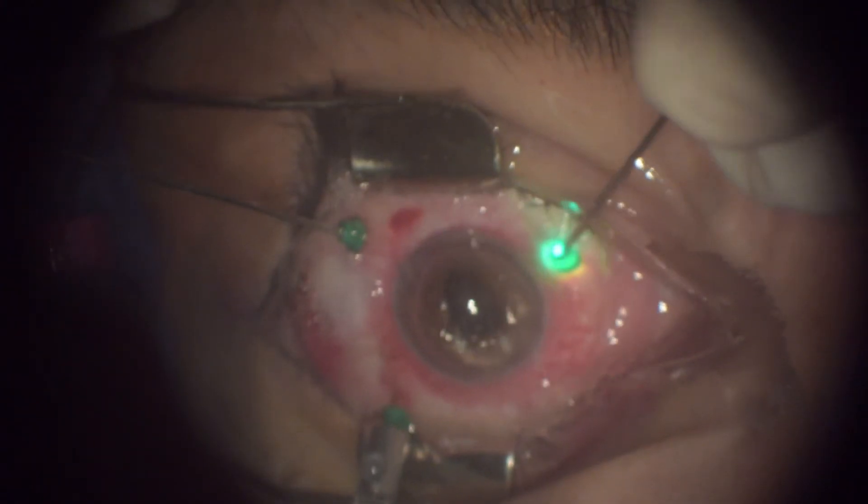We finished the case with an air-fluid exchange, and it was not necessary to relieve the retina periphery because it was quite attached. Thank you very much.